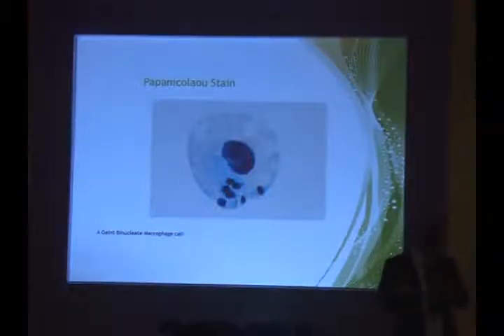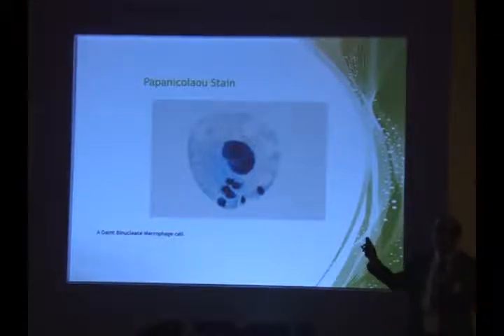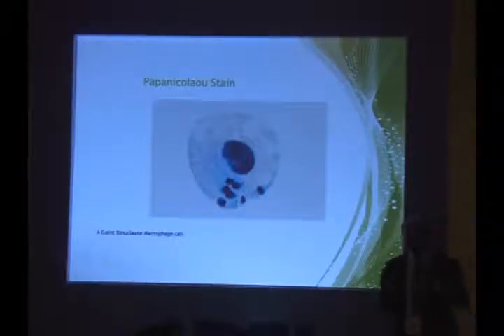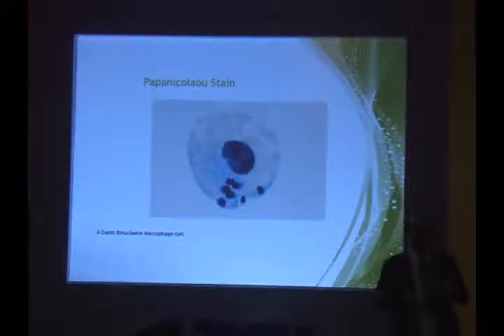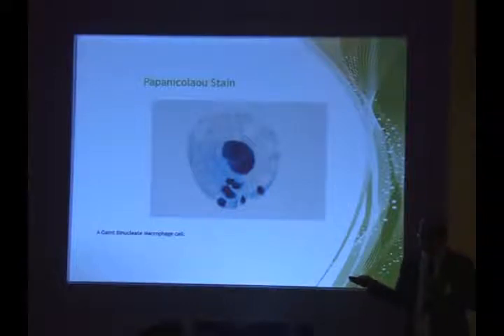So this patient could be having anti-sperm antibodies, it could be having a low-grade infection, it could be because of some testicular stress, but it indicates increased sperm death. Commonest is infection and antibodies, but any testicular stress can produce sperm death. So a higher number of macrophage cells is indicating that you have to look for sperm antibodies, and you can advise semen culture in this patient. And be very careful when you report.